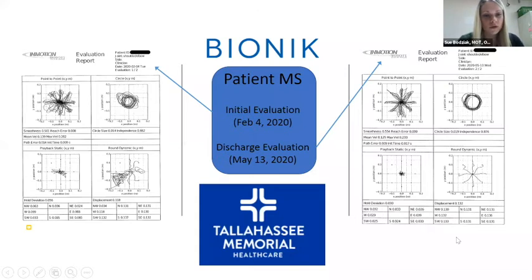We also would use the screen because he has a glass eye in his left eye. So he is using his right eye to compensate. So we would put the screen to the left side so he was able to visually scan to compensate for that vision loss. That was also a really great aspect of the robot. But you can see that from February into the next 3 months that we did it, he was able to improve by a huge significance.